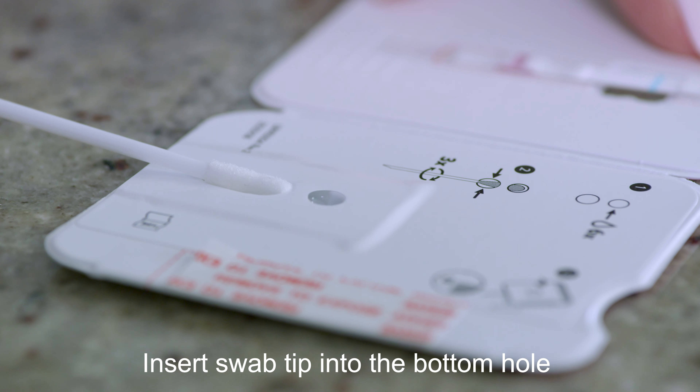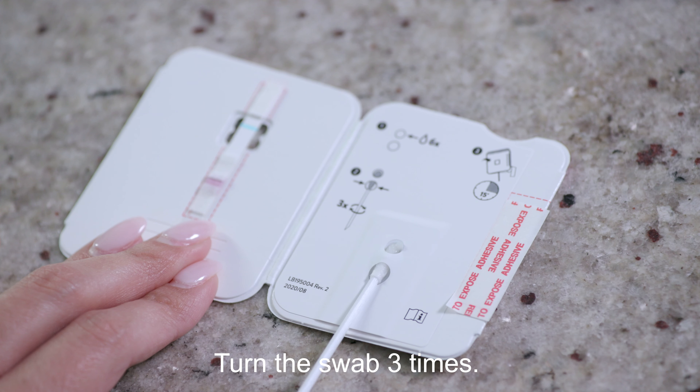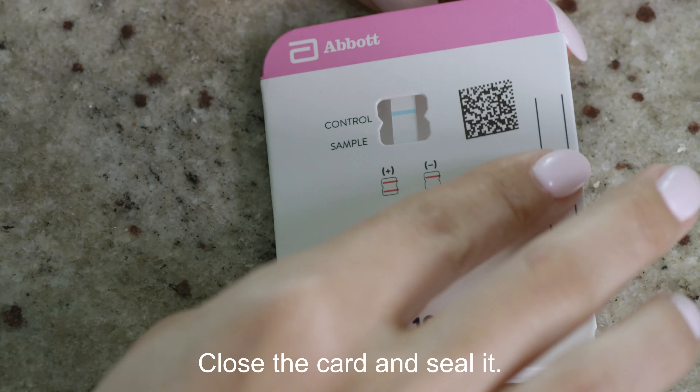Insert the swab tip into the bottom hole of the card and push up until it fills the top hole. Turn the swab three times. Peel off the adhesive liner, then close the card and seal it.